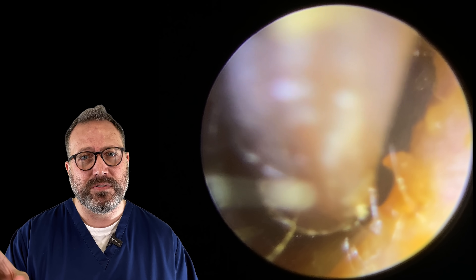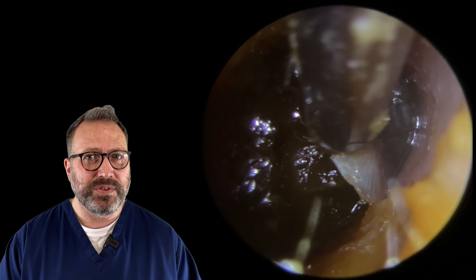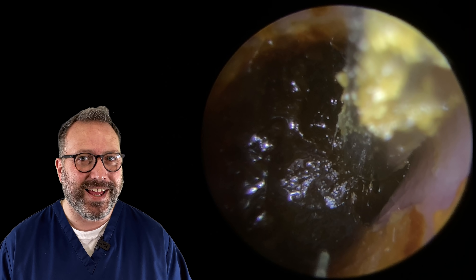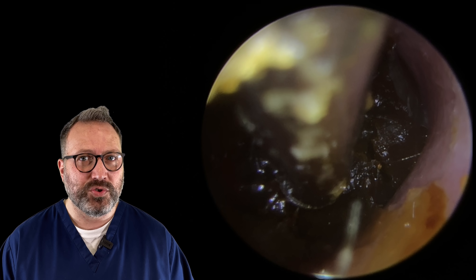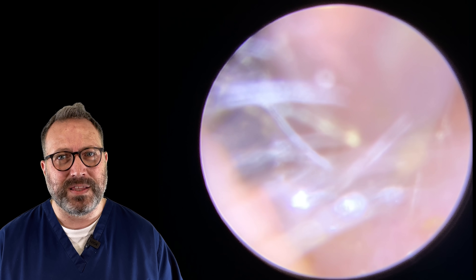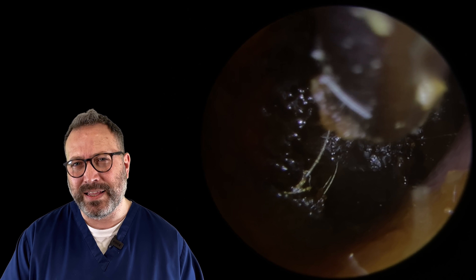We've started the peel to the right corner and I want to see if we can get a little bit more of a peel going, so I'm just going to try and loosen this a little bit more. As we are lifting from this right side it's just drawing a little bit more of the peel from the bottom left, but unfortunately now it's detached. We tried from the outside edge but it didn't really budge. The wax itself is so thin - you can see just how thin that layer is - it's unfortunately not solid enough to get a really good peel.